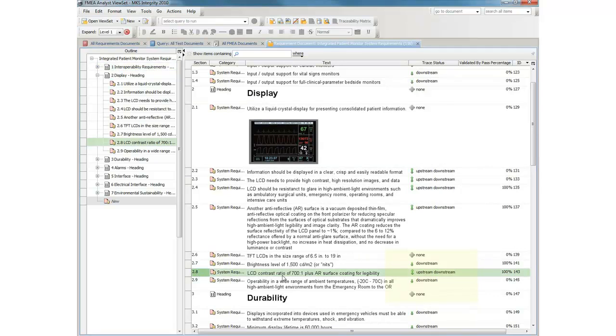For this particular requirement, we can see that there are both upstream and downstream traces. We can also see the past fail percentages of the test cases that have been executed against each requirement.